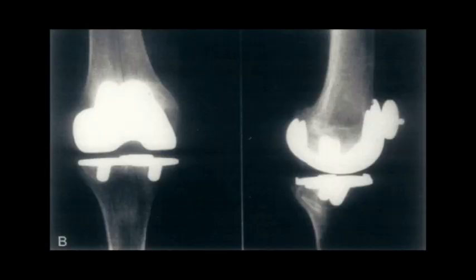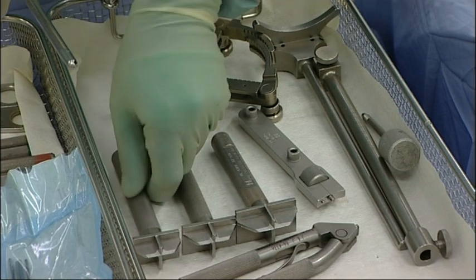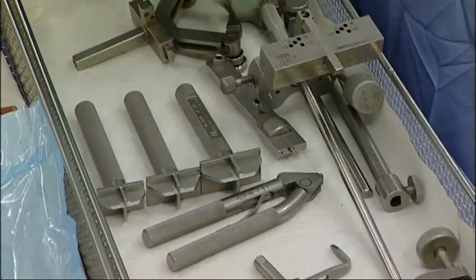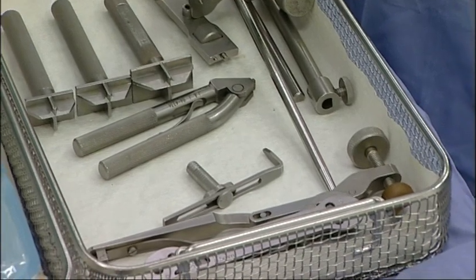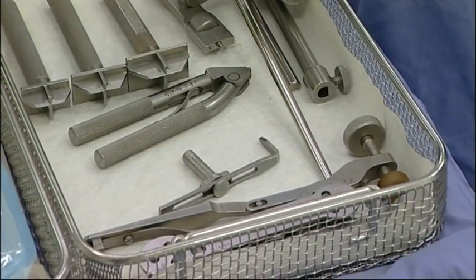As the name implies, the total condylar prosthesis resurfaced all of the articular surfaces. In addition, it relied on soft tissue balancing to provide alignment and stability. All these features predicated the development of dedicated instruments for insertion, an innovation that was soon to become commonplace.